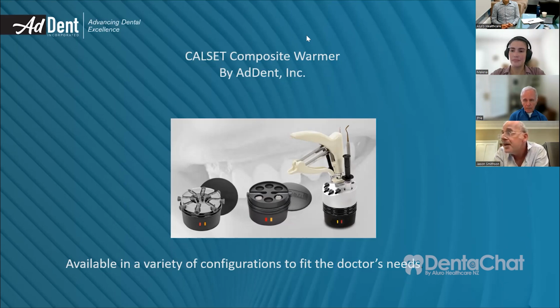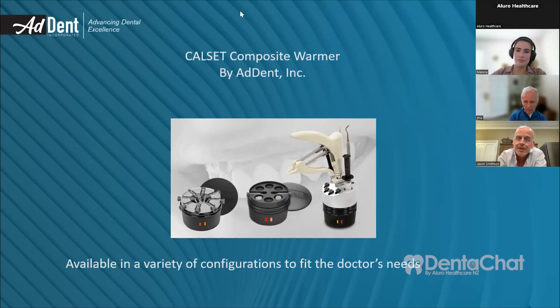I probably used it for less time with veneers. And the reason for that really is because historically I was using feldspathic veneers, stacked veneers, and very, very thin feldspathic veneers. If you use heated composite, because of the pressure you have to apply to seat the veneers with the heated composite, you might crack them. But nowadays, I've switched over pretty much universally to lithium disilicate. So even with thin lithium disilicate veneers, 0.3, 0.5, which is super thin, I've never cracked one with heated resin. So I've got a reasonable follow-up with veneers now. And actually, the advantages with the veneers are exactly the same as the onlays.